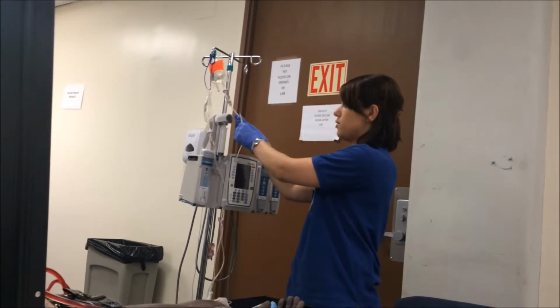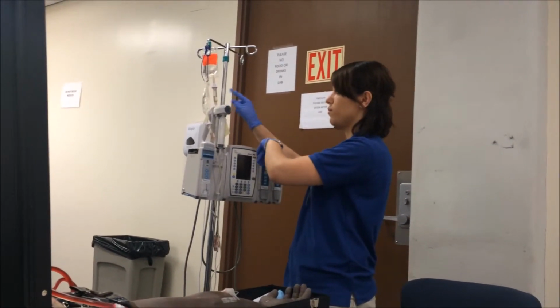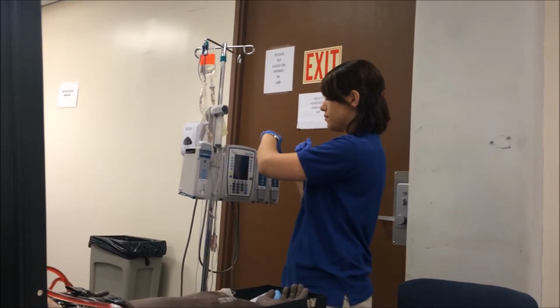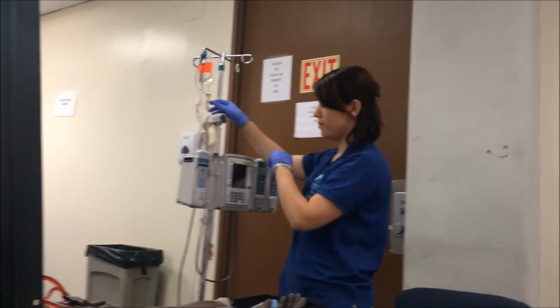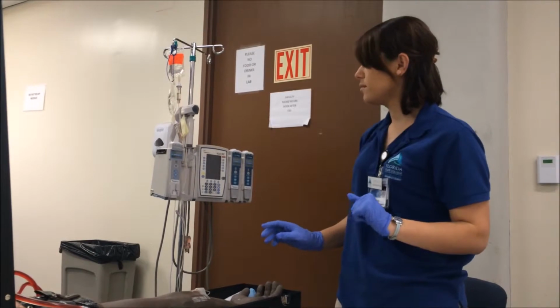And my flow rate, we said earlier, is 33 drops per minute, but I will establish it for 1 minute. Okay, so 33 drops per minute. There we go.